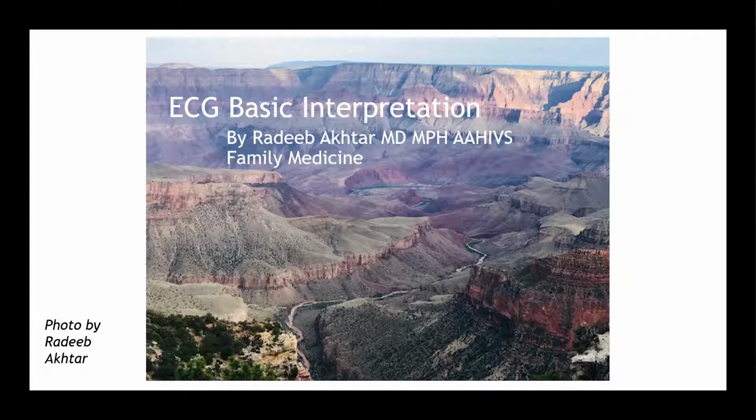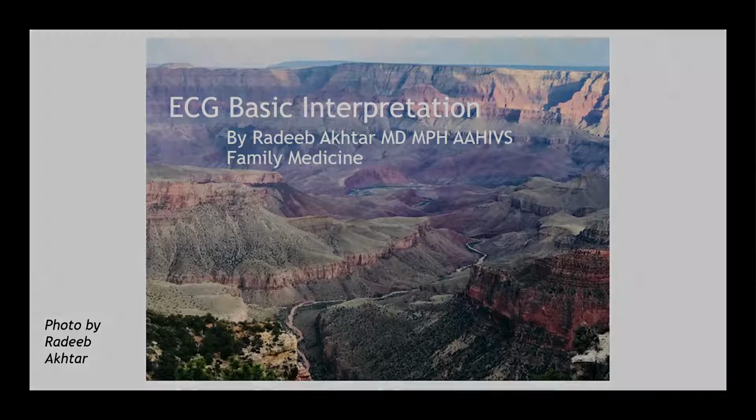Today we'll be talking about ECG interpretation. We'll be going over practical and quick interpretation of an ECG here. So the things that I won't be covering: I will not be talking about conduction physiology, how to record an ECG, and pathophysiology. This talk is mainly geared towards our residents who are starting, but anybody who wants to know how to do a rapid interpretation, this is a good one to review. All right, why don't we begin?